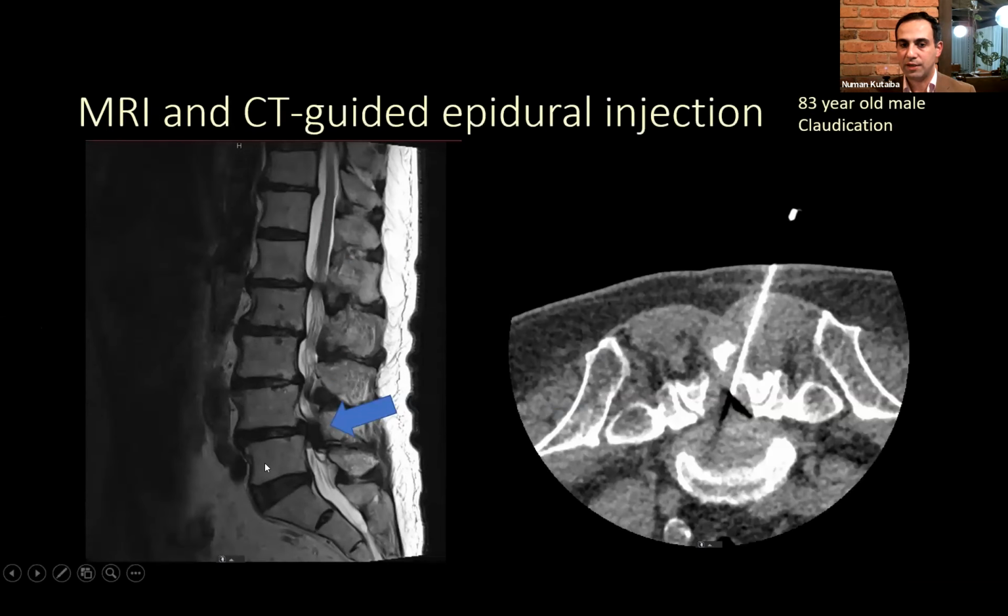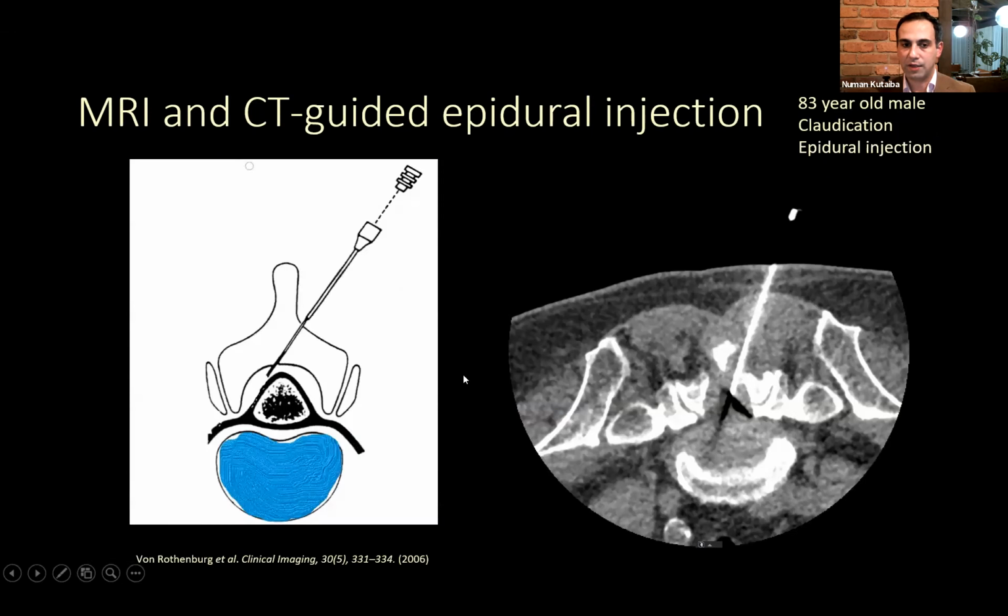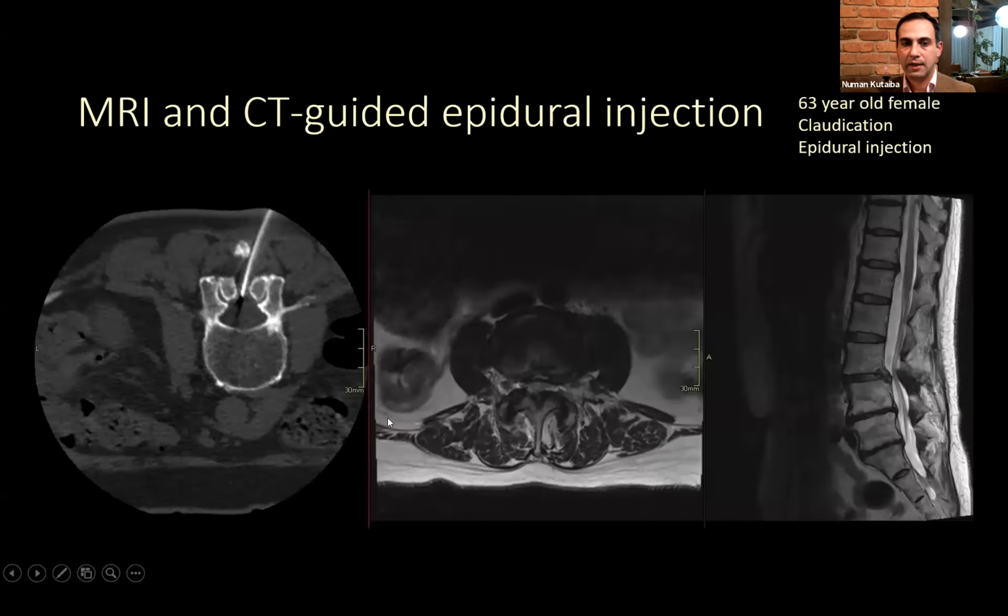Now, how do you treat this patient? It depends on whether you need surgery or not. You try to shy away from surgery. At this age, they may have comorbidities. So you try to address this with an epidural injection. Again, this is done under CT guidance, where you advance the needle outside the thecal sac and in the epidural fat, you put in some steroids and local anesthetic.